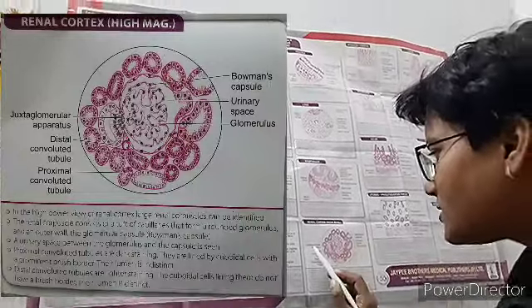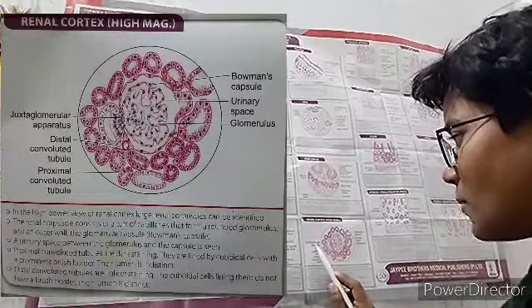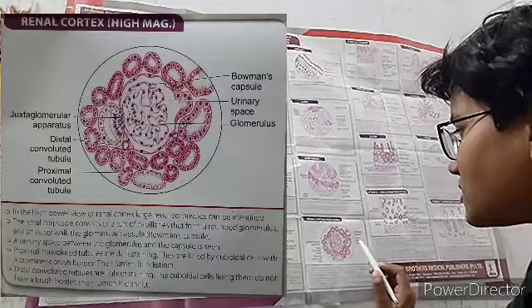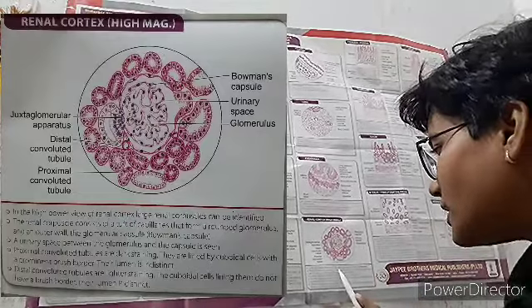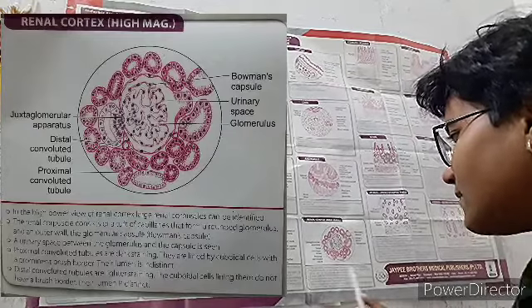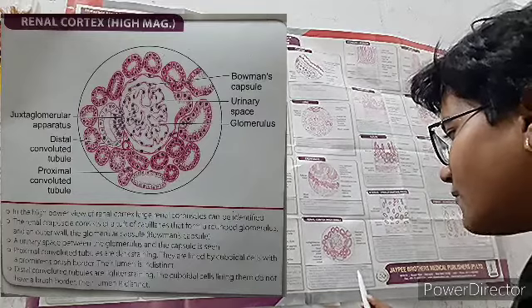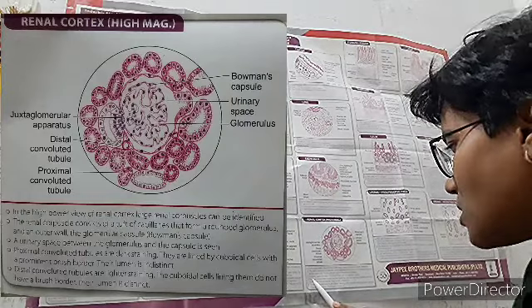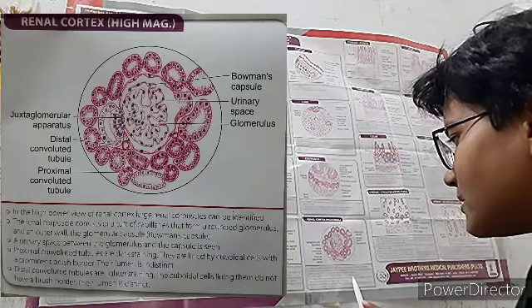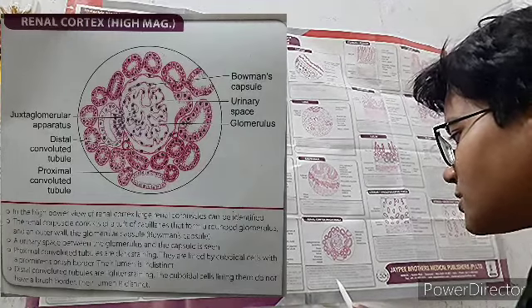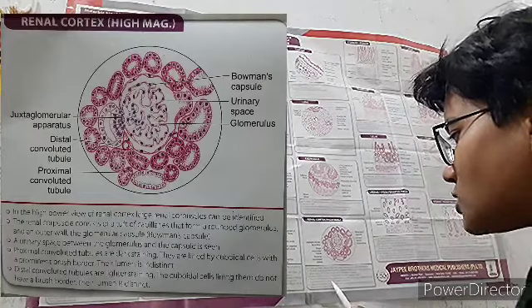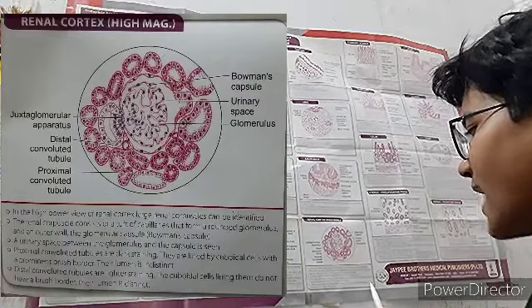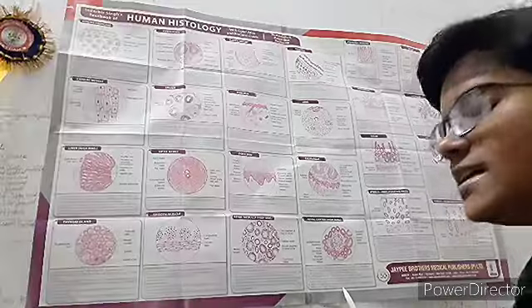Now the renal cortex at high magnification. Visible structures include the juxtaglomerular apparatus, distal convoluted tubule, proximal convoluted tubule, Bowman's capsule, urinary space, and glomerulus. Large renal corpuscles can be identified, consisting of tuft capillaries forming a rounded glomerulus and an outer wall called the glomerular capsule or Bowman's capsule. A urinary space between the glomerulus and the capsule is seen. Proximal convoluted tubules are dark staining, lined by cuboidal cells with a prominent brush border and indistinct lumen. Distal convoluted tubules are lighter staining, with cuboidal cells lacking a brush border.